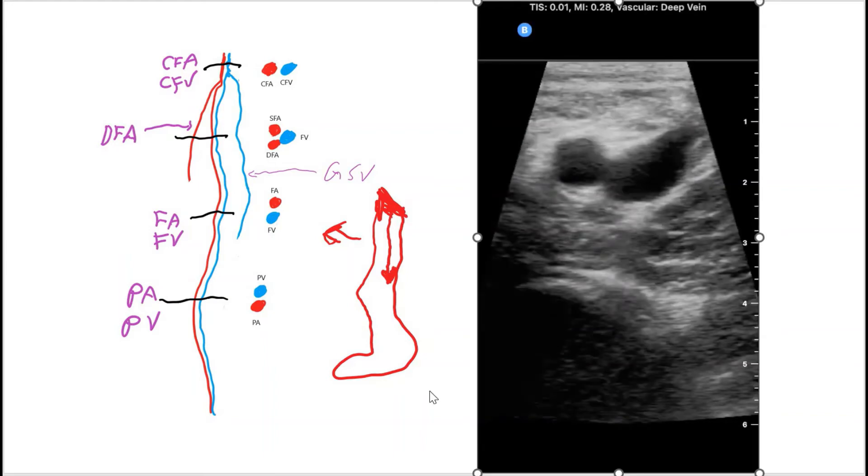As you are scanning you're also compressing down to see if the vessel completely collapses. The vein will collapse and if it collapses then that means there's no DVT. And if there is a clot it won't collapse completely. So we start scanning from the inguinal area and as you are going down we'll be compressing.